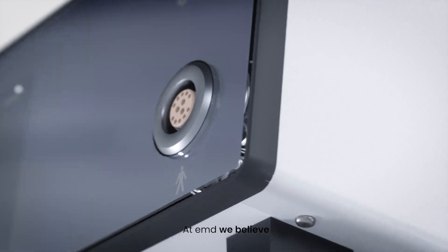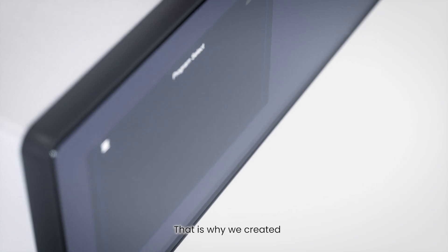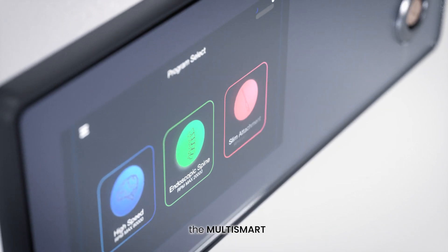At EMD, we believe in leading instead of following. That is why we created the Multismart.